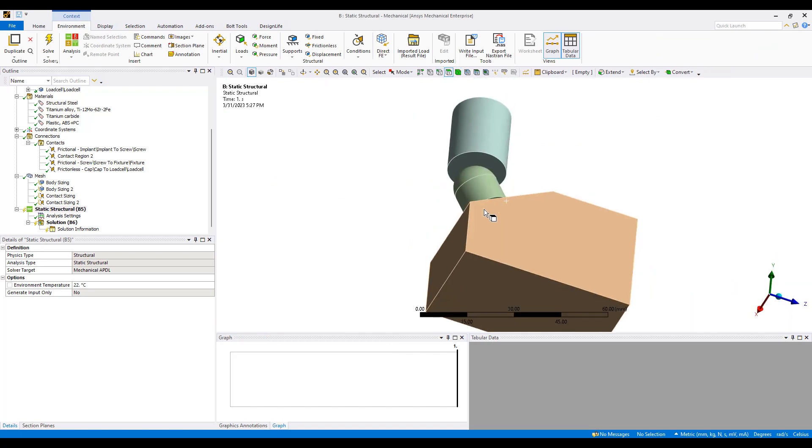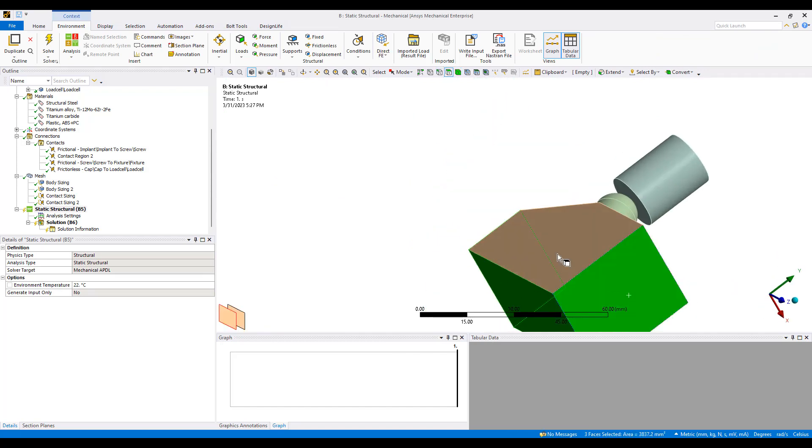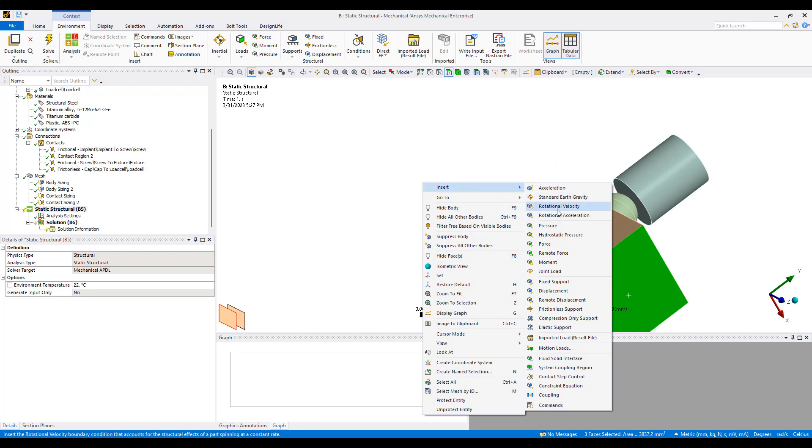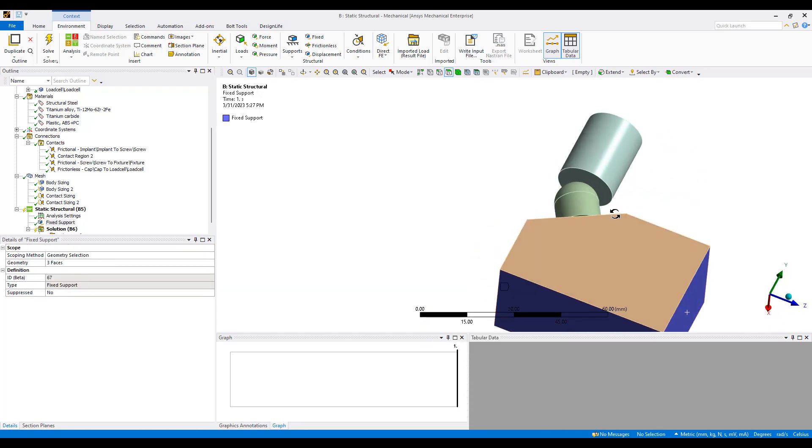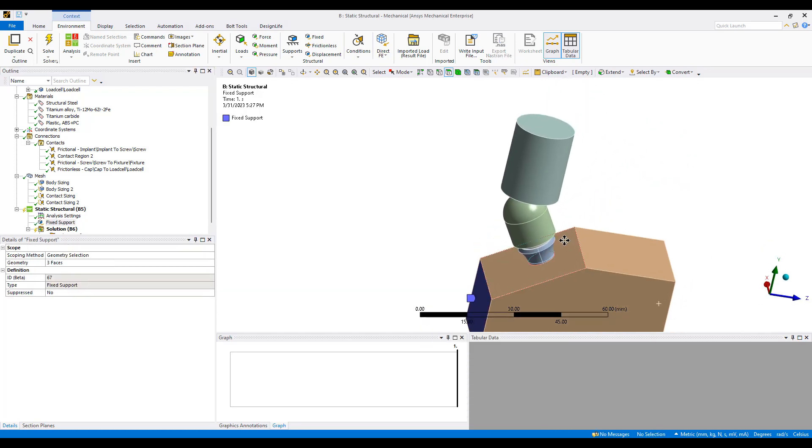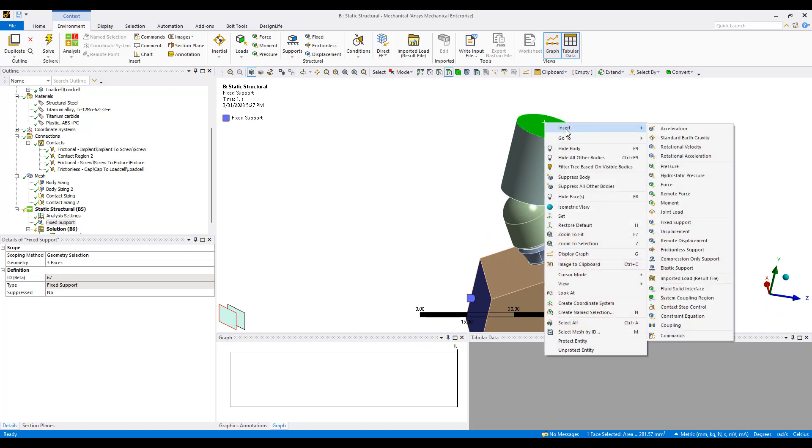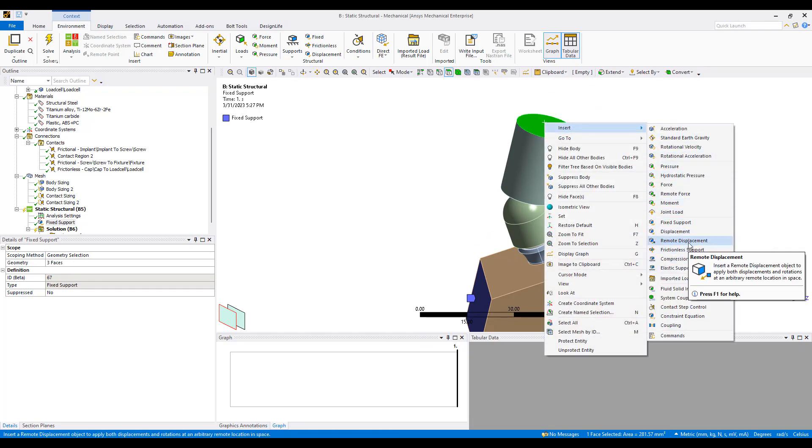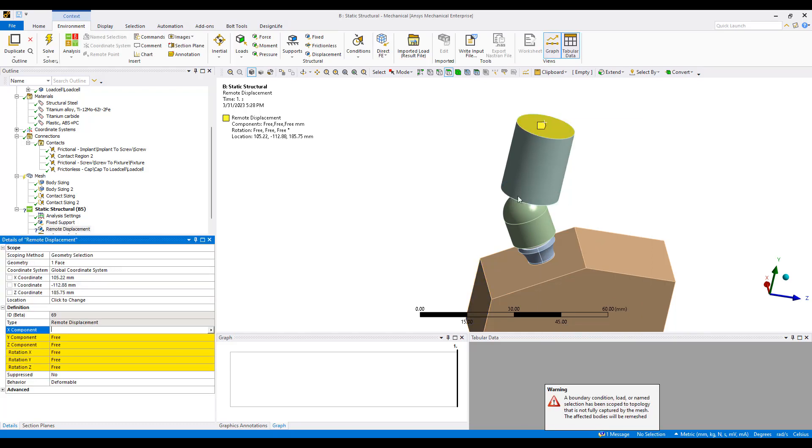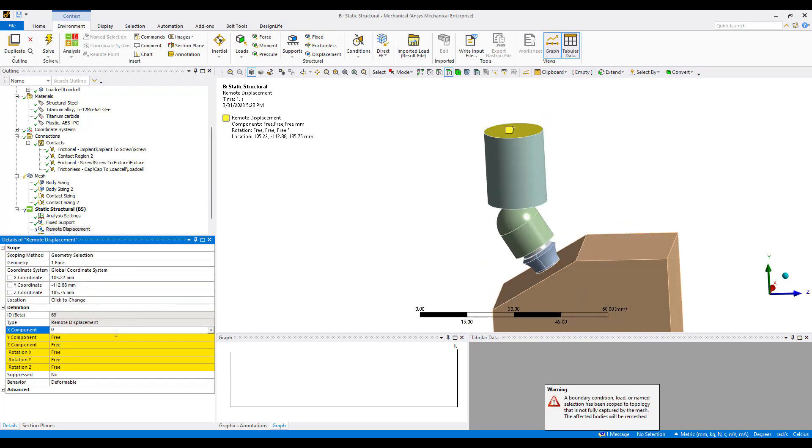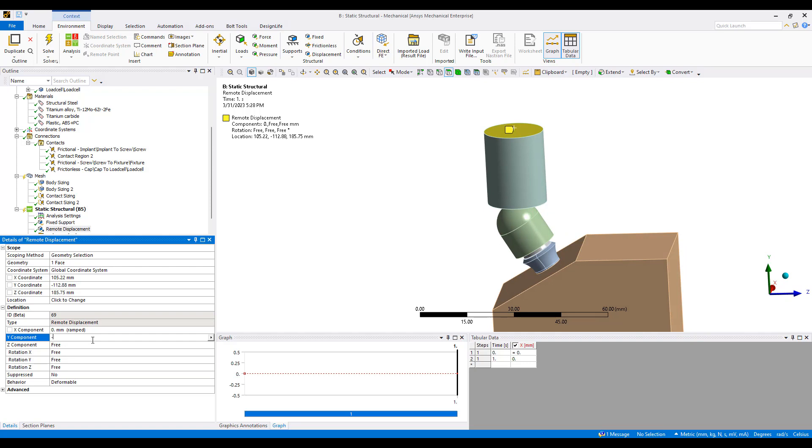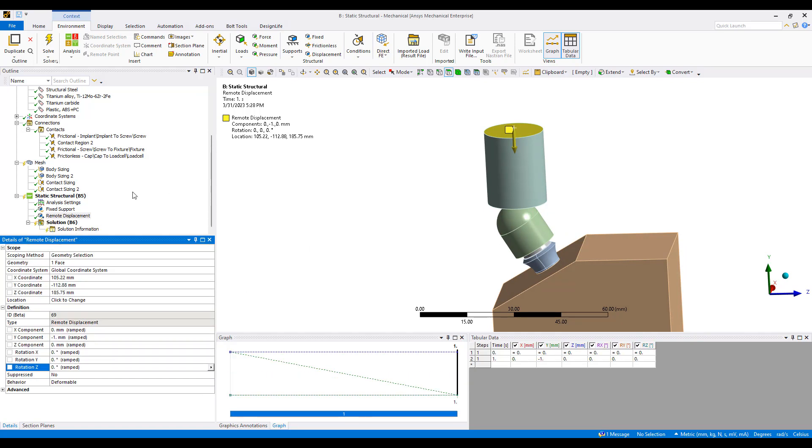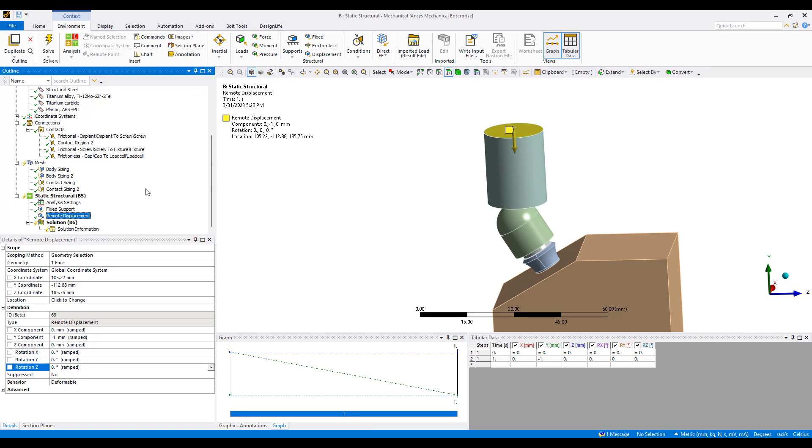We're going to support this area with fixed support and we're going to move this surface down because this is a rigid body component we can assign remote displacement. It's going to be moving minus one millimeter downwards and we're going to fix all the other degrees of freedom. And now we run the simulation.